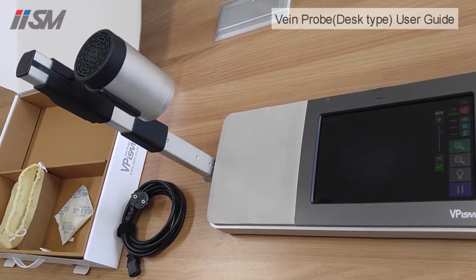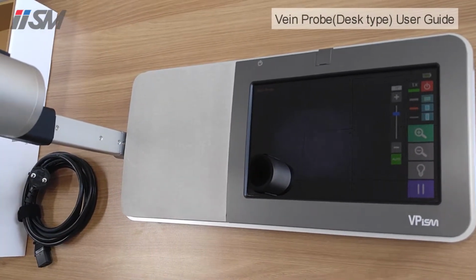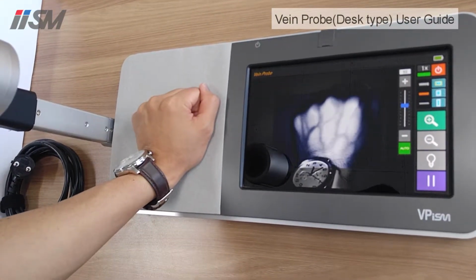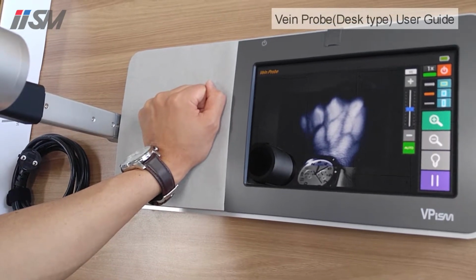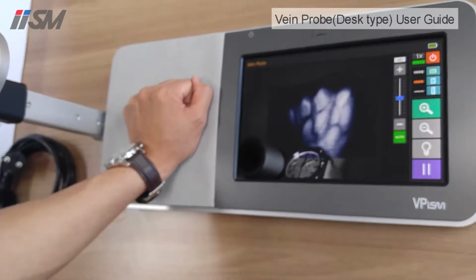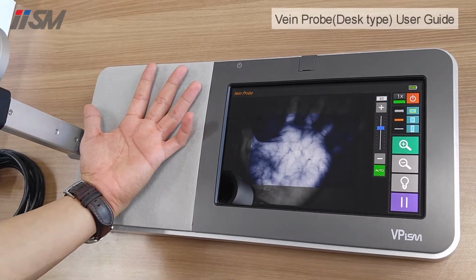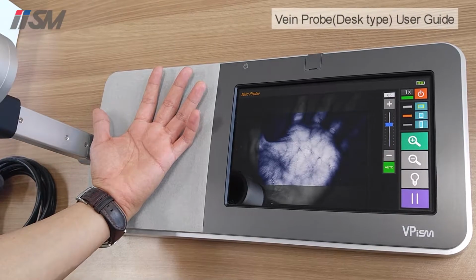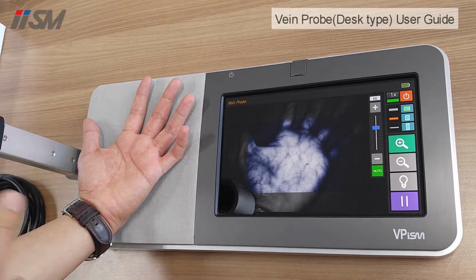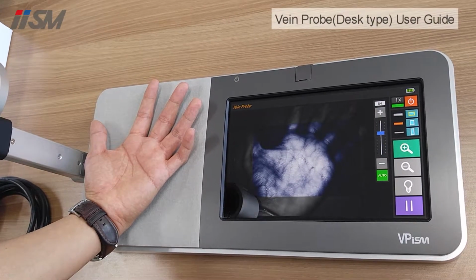Okay. So right now, if you see at the screen, you see that it is dark. That is the normal standby mode. It is in dark mode. Now if you place your hand, you see that the brightness automatically adjusts to find the optimal brightness to see the veins. In the beginning there is no need for any calibration of the device itself, of the camera, or of the LED, because all that calibration has been done by us before we release the product to you.